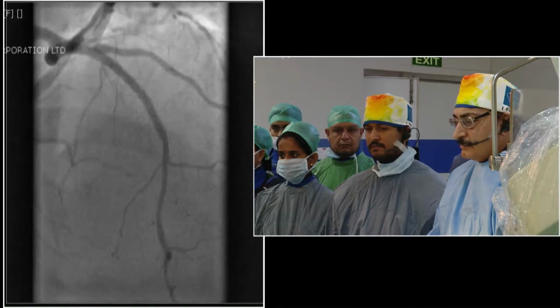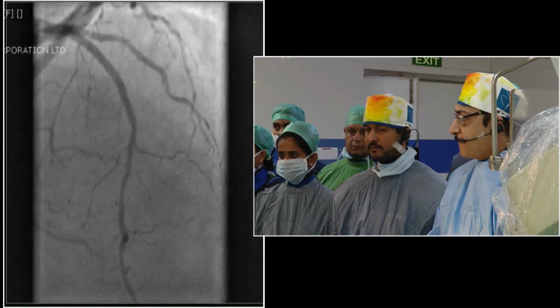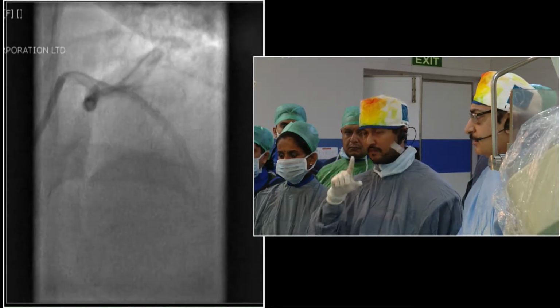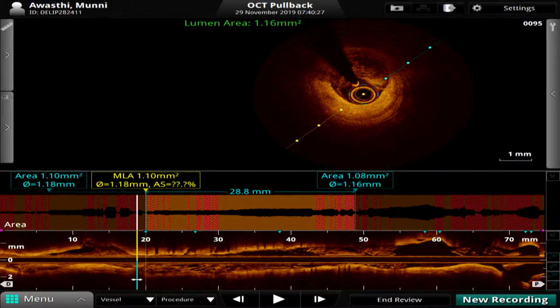Hello, everyone. So we have done. Can you hear Mr. Farzan? Hello. We can hear. Okay. Can you see the OCT image? No, we can't. Can you show us the OCT pictures, Khanna? Can somebody focus on the OCT? Okay, so you got it.